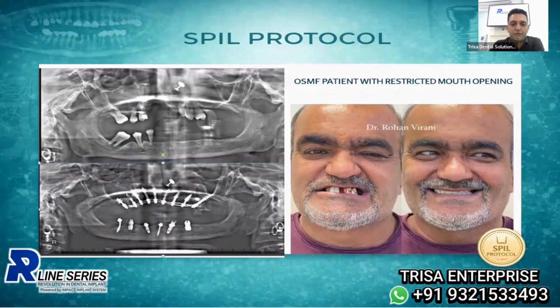What we did is right in front of you: upper jaw, cement retained basal implants; lower jaw, right side mandible, BCS MU, DSI implant, which is a two-piece implant, screw retained next to it, all dependent on the basis of bone available and mouth opening. Next to it is a CIH implant from the Impact R-Line series, connected with a multi-unit, a BCS MU in the anterior mandible, a DSI on the right side and another DSI on the right side, giving a screw retained prosthetic which takes care of his extraction socket, and more importantly, allows me to remove his prosthesis, work on the upper jaw, and then simply screw the lower prosthesis back in, which means my maintenance also becomes very easy.